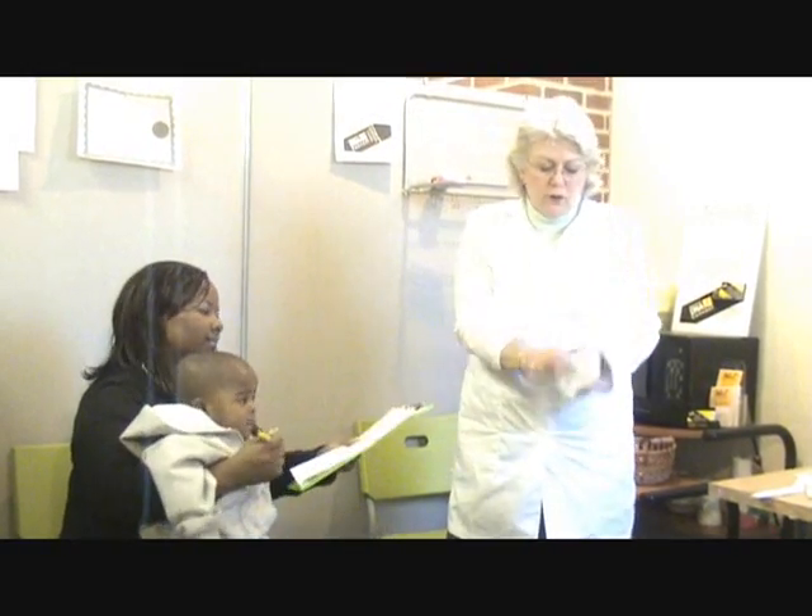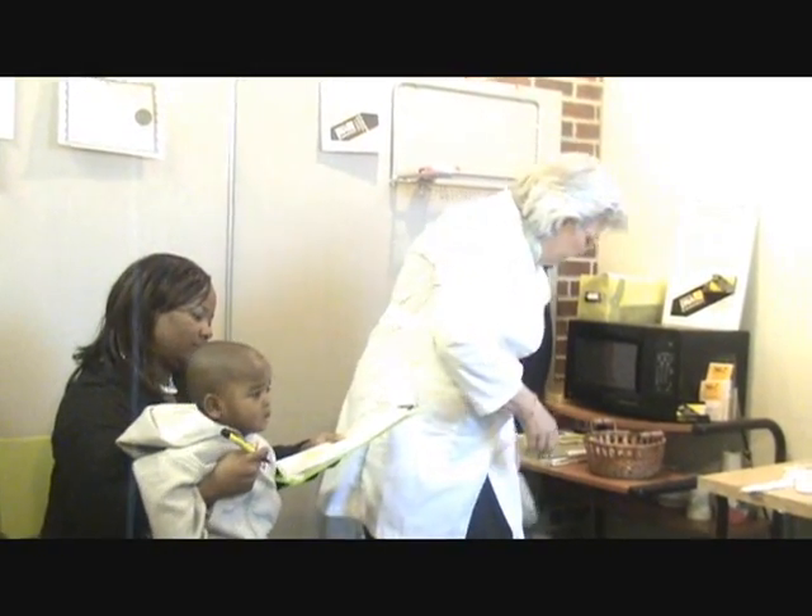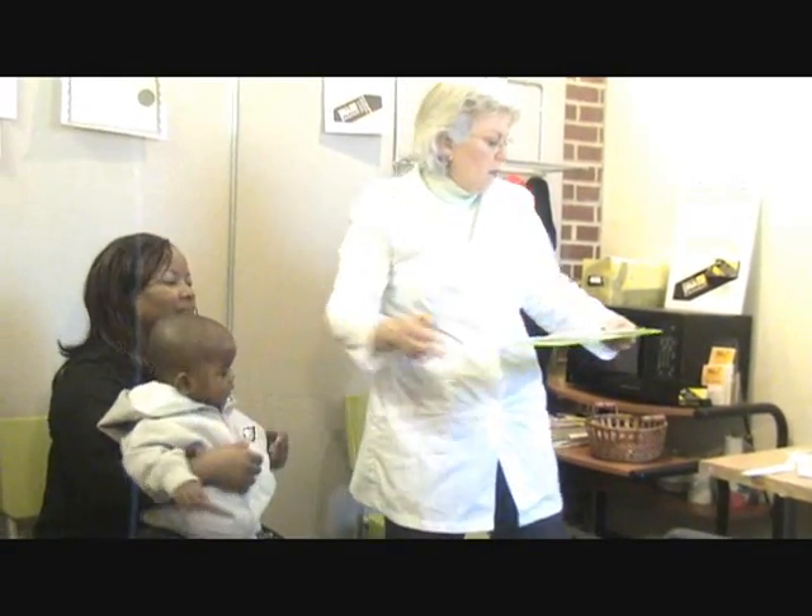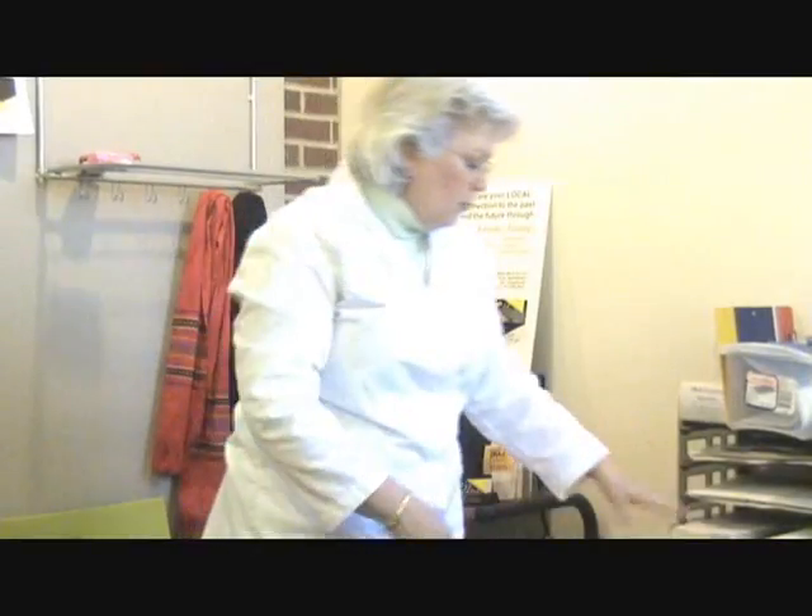I can take the gloves off, turn them inside out, and discard them. Thank you very much. There you are — the sample collection.